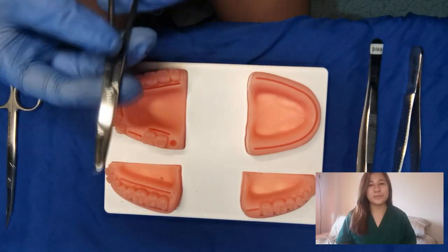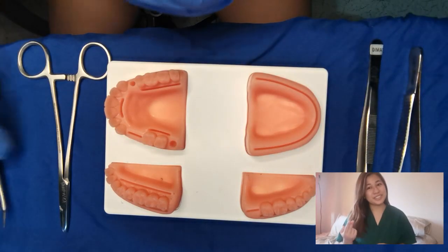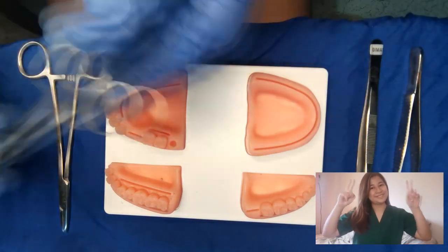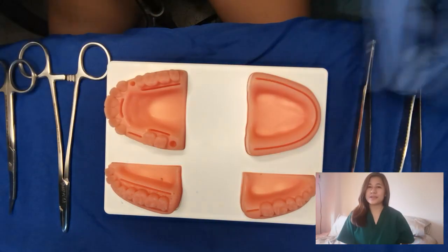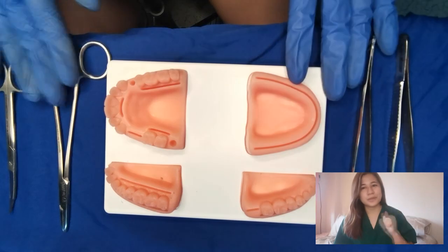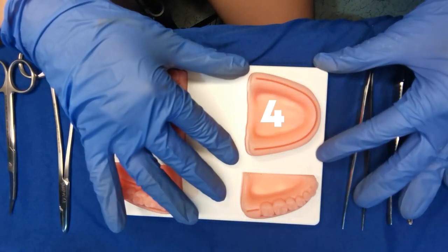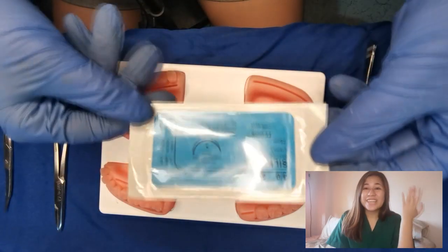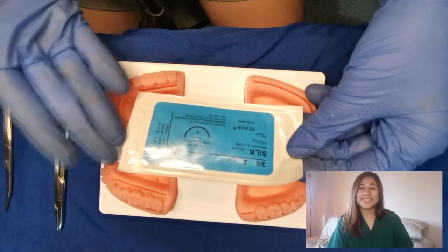In our armamentarium, we have the needle holder, surgical scissors over there, and then we have forceps. So me, I have 2 forceps. Material is silk. It is the most commonly used in the field of dentistry.